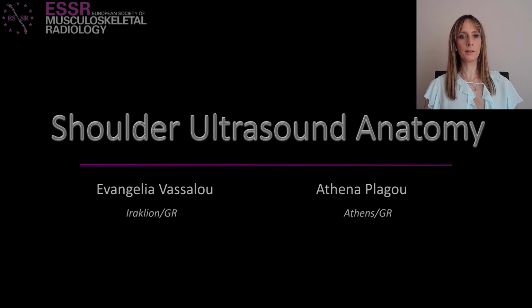To conclude, in the second part of our shoulder anatomy demo, we demonstrated the dynamic maneuvers that are frequently used during a routine shoulder examination. We evaluated the ultrasound appearances of infraspinatus and teres minor tendons using a posterior approach, and demonstrated the structures that can be studied with ultrasound in the posterior aspect, such as the posterior glenohumeral joint recess and the suprascapular and spinoglenoid notches.